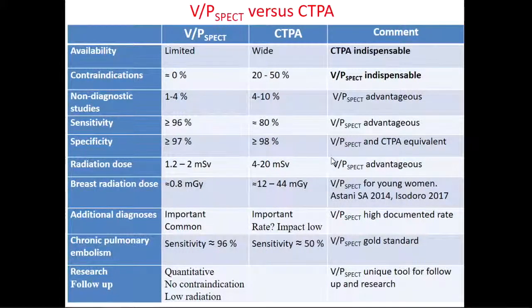The radiation dose in clinical routine is still about 4 times higher or more for CTPA than for VP SPECT. Particularly the radiation dose is very significantly higher. So VP SPECT should be done in young women particularly.